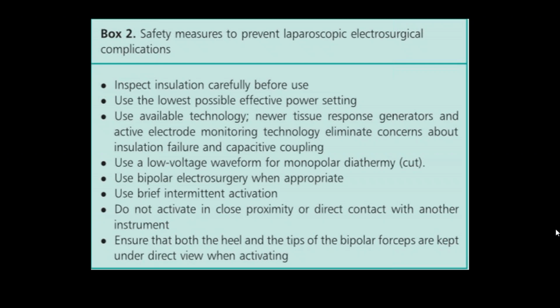Don't put the clamp like this during hysterectomy, you will make an injury to the ureter. Don't take a very deep stitch, the ureter will be involved. So please, where is the ureter? Please, let me feel it. Let me see it. Those are the two most important things to identify the ureter intraoperatively.